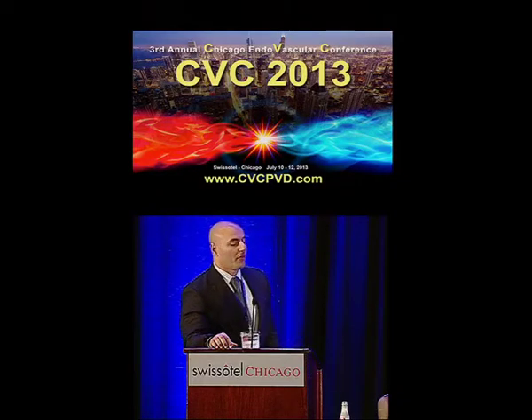Well, let me ask you this. Are you from the school of thought of what I call the helicopter technique, where you take the catheter and twirl it? Because we've seen with a lot of the unstable patients that when you do that technique, they tend to become a little bit unstable. Well, anything that can induce a cardiac arrhythmia will make them worse.